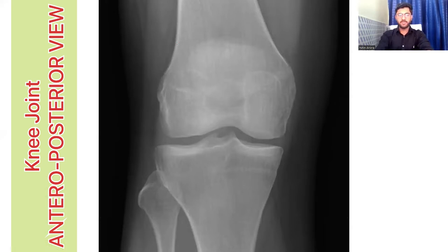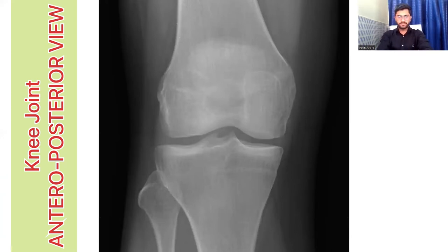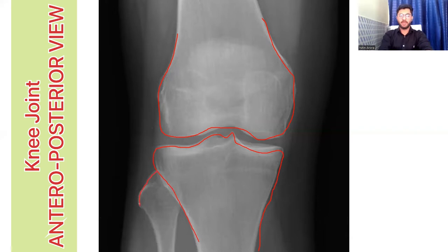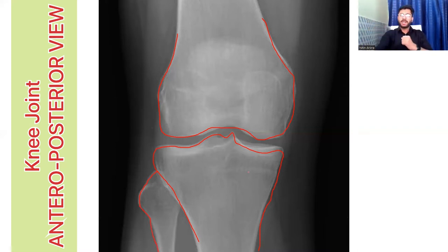So now in this AP view, what you can see is the femur bone on the top. Three bones are clearly visible here. One is the femur — this complete bone you see here is the lower part of femur, the distal part of femur. This bone here is the tibia — the proximal part of tibia. And this is what we call the fibula, the lateral bone of the knee joint. The knee joint is composed of femur, tibia and fibula.